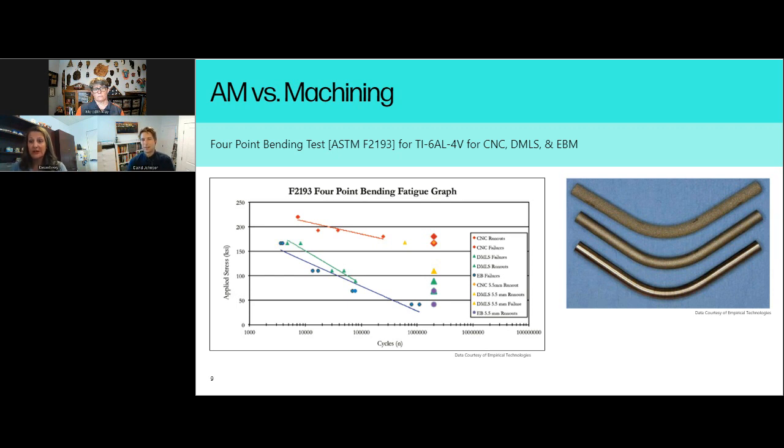So when we talk about a lattice structure, that's where we really had to adjust. Well, two things have impacted how we hold a device, right? So you have fixtures that have the setup that are attached to the test frame and the load cell. So that's where you're getting your inputs and your outputs. But what holds the device itself are the test blocks. And so for static testing, it's a stainless steel block. For dynamic testing, it's usually polyethylene or polyacetal.